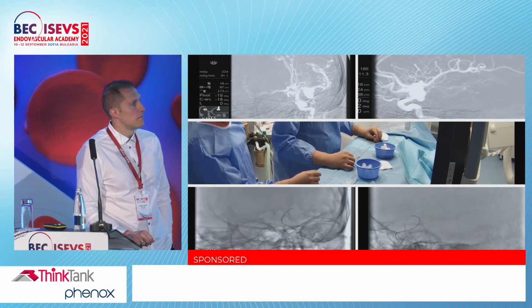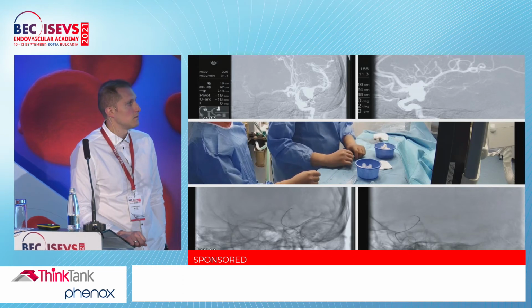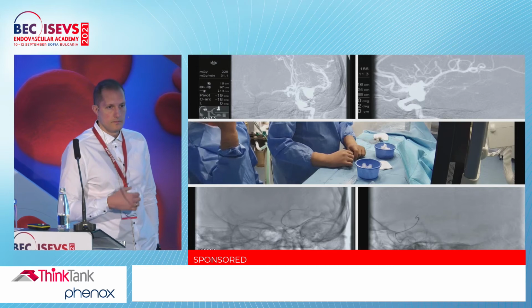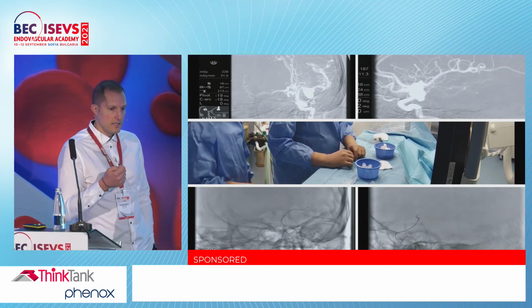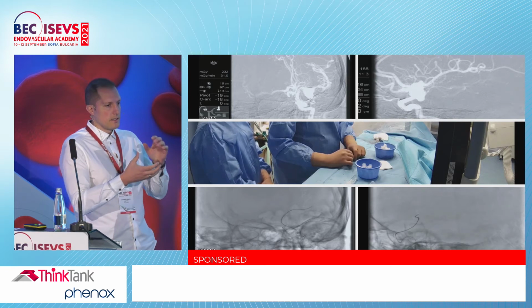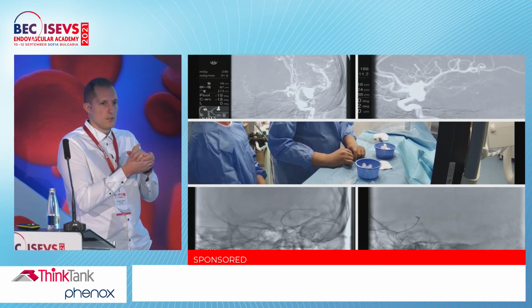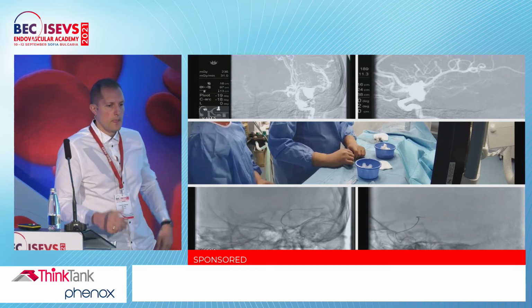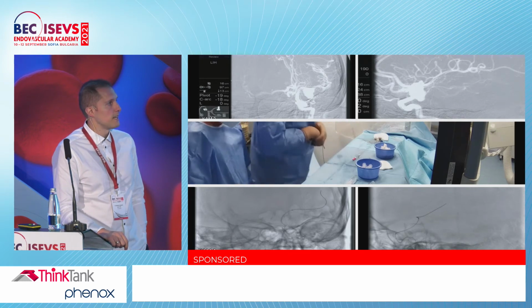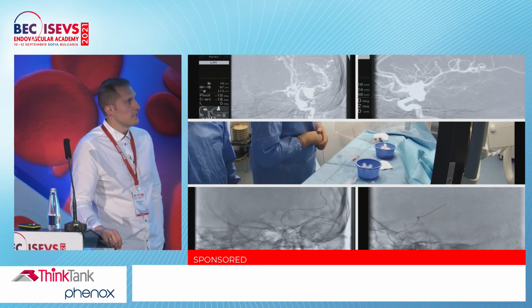For this purpose, I think the best stent available on the market is the P64 stent. Like you know, it's completely resheathable. You can deliver it fully, and at the proximal end there are 8 markers gathered together. So when you decide this is your position, you can just detach it. In this case, you will see we had to try several positionings of the stent until we were satisfied with the positioning of it.